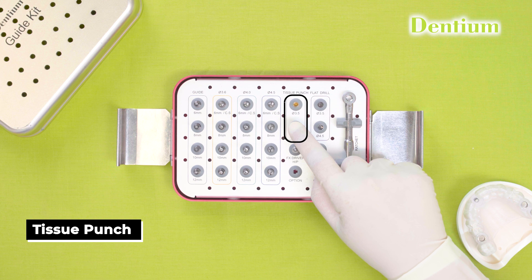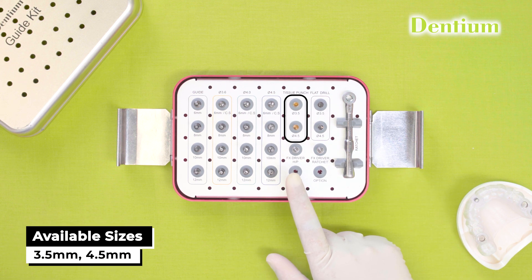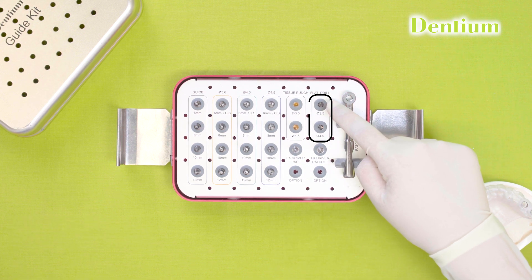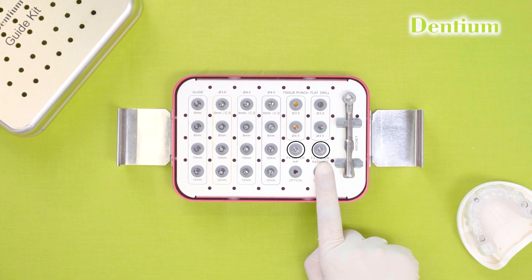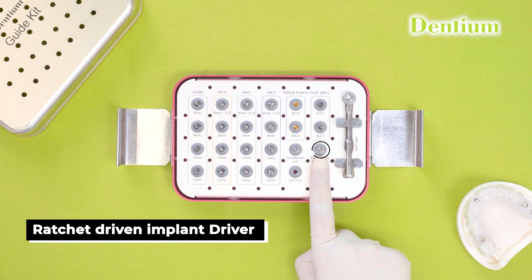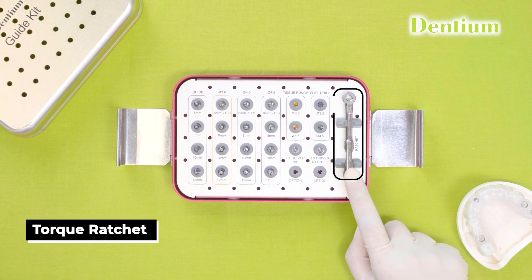These are the tissue punches, available in 2 diameters: 3.5 and 4.5. These 2 are the flat drills, available in 2 diameters: 3.5 and 4.5. These 2 are implant drivers — this is the handpiece driven implant driver, this is the ratchet driven implant driver, and this one is the ratchet.